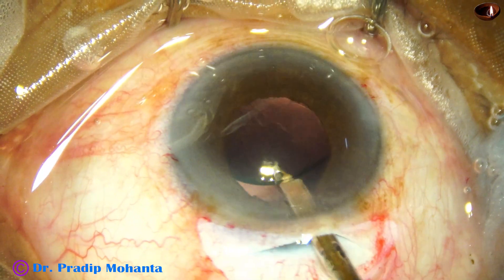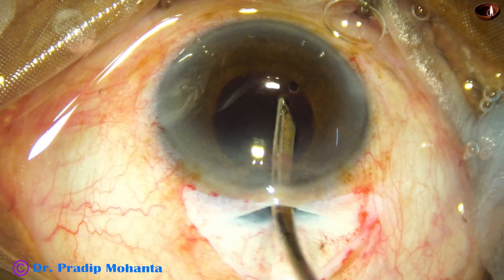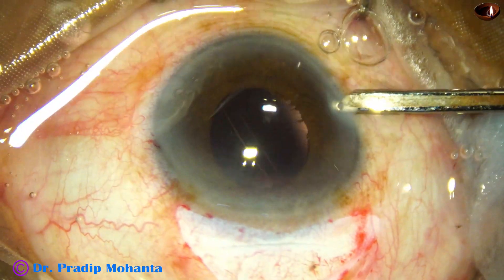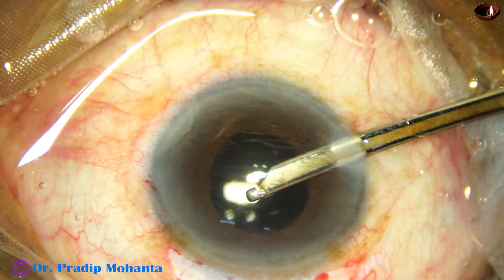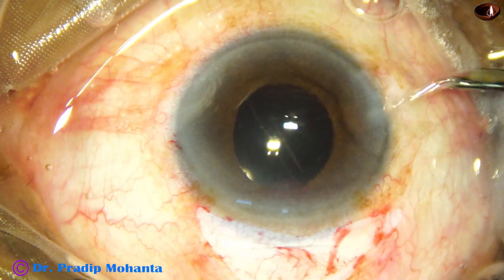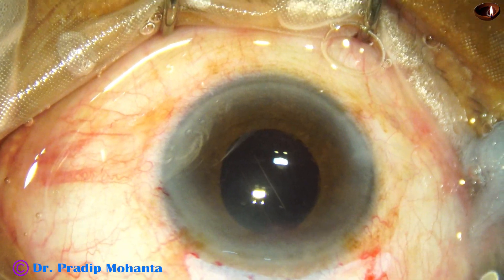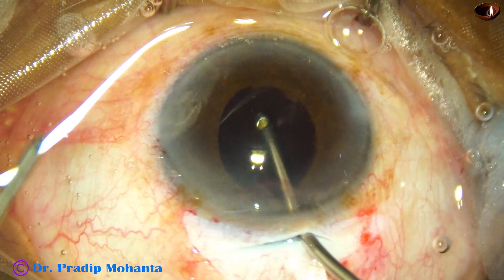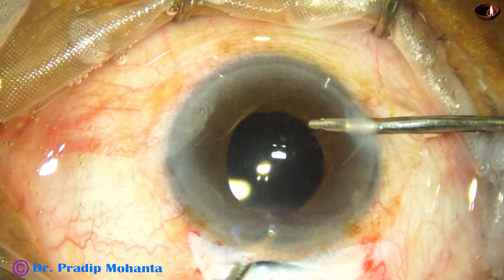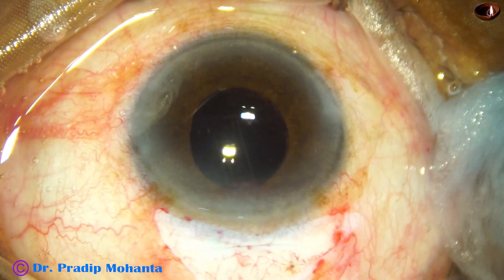After placing the lens in the capsular bag, all the viscoelastic behind and in front of the lens has to be removed. Unless we remove the visco nicely and are meticulous about it, we cannot be good surgeons. Always remove the visco very meticulously, because retained visco can cause a lot of discomfort to the patient. It can increase intraocular pressure, cause steamy corneal edema, and even uveitis can occur. I am now using bimanual irrigation-aspiration to remove some more visco.